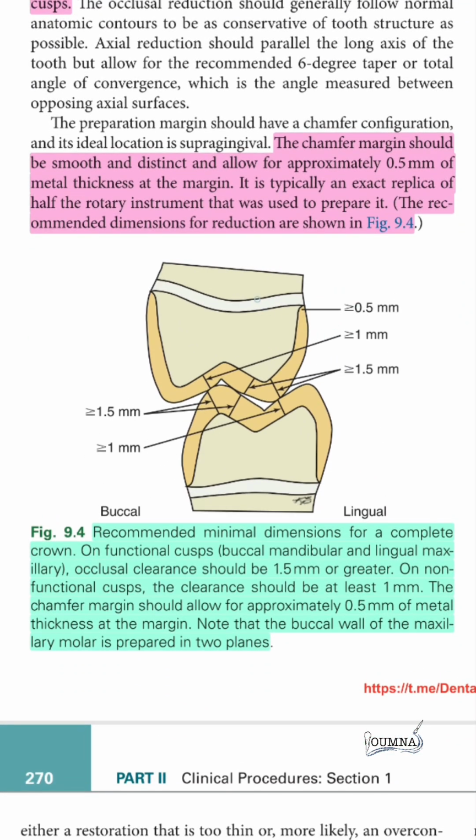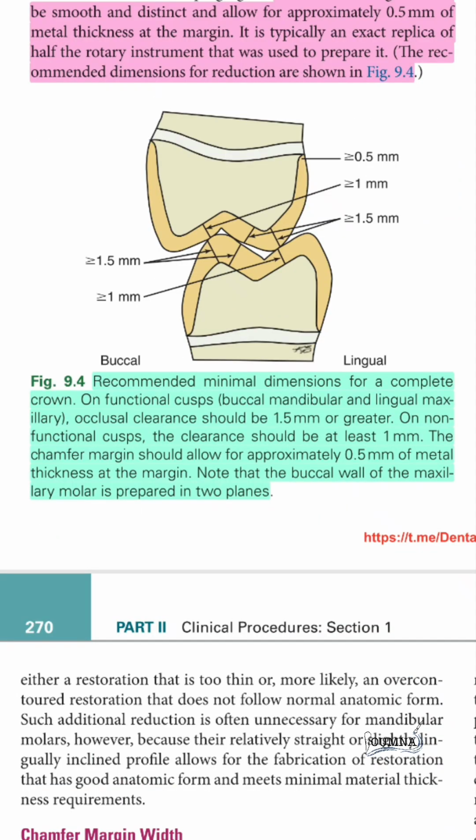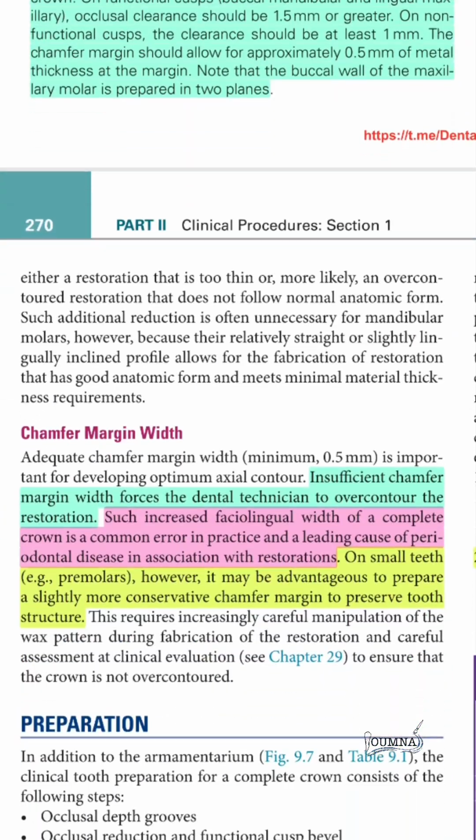As for the margin, it is a chamfer, and it should be at minimum 0.5 millimeter in thickness, which is an exact replica of half the rotary instrument that is used to prepare it. As always, it must be smooth and free of any irregularities. When we are preparing for a metal restoration, we need a 0.5 millimeter margin. For ceramic, we need a 1 millimeter margin thickness.